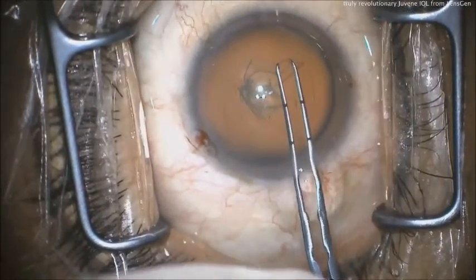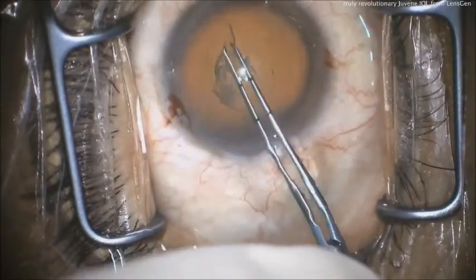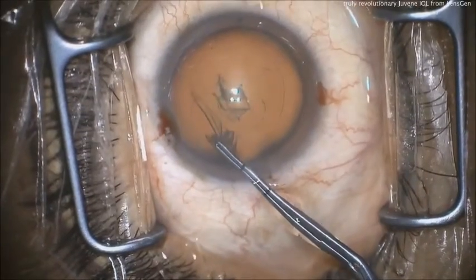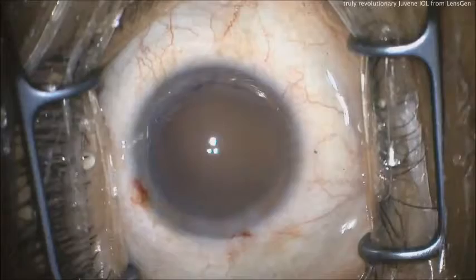The rhexis is very important with this lens. You're filling the capsule bag, so you can't have a radialized rhexis — you've got to complete the rhexis. You can use a femto, a zepto, or forceps, whatever makes you happy. The target size is about 5.5 millimeters.